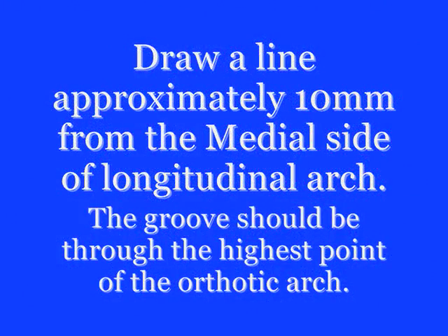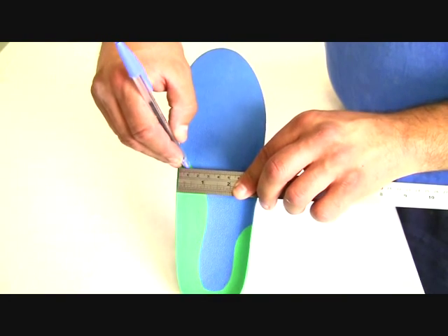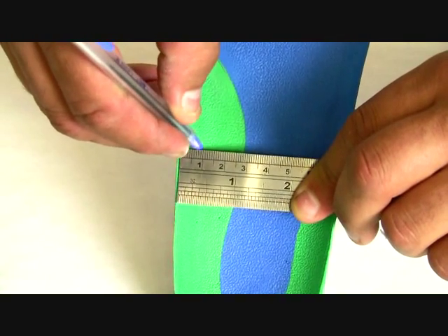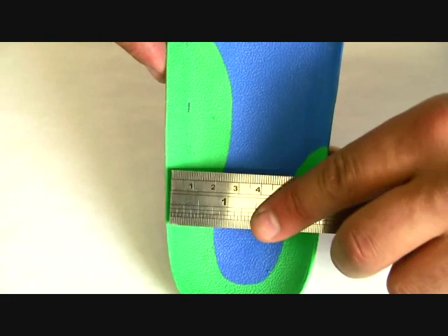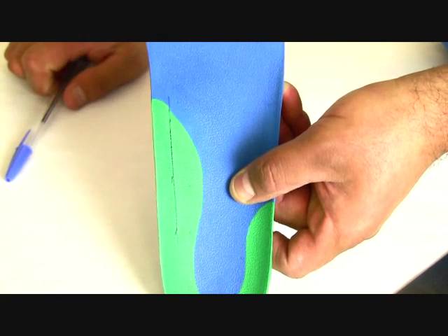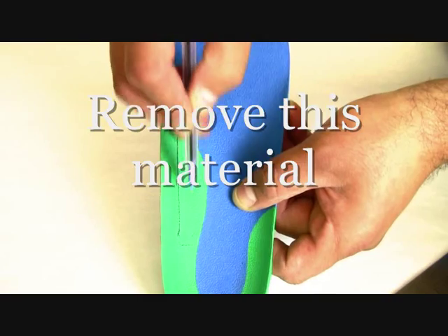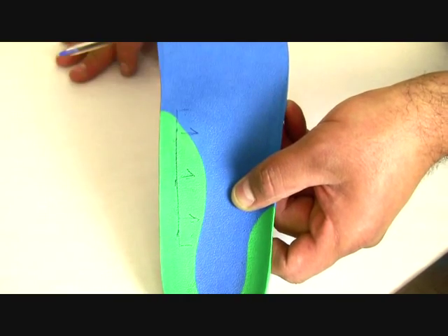Mark out and draw a line approximately 1cm from the medial aspect of the longitudinal arch. The line should be the full length of the arch. However, when you are making the groove, you will only take the material away from the highest point of the arch. Here the technician is marking the area that needs to be removed once you start the grinding process.